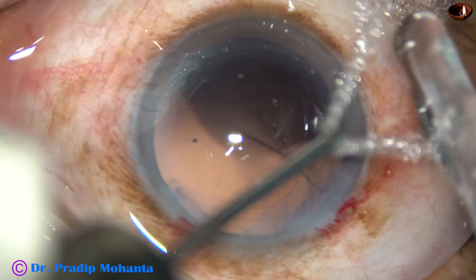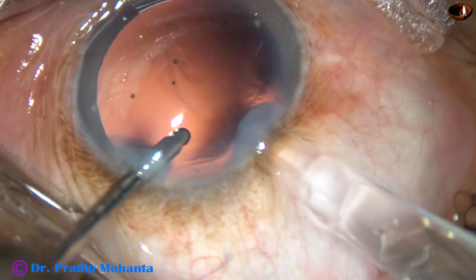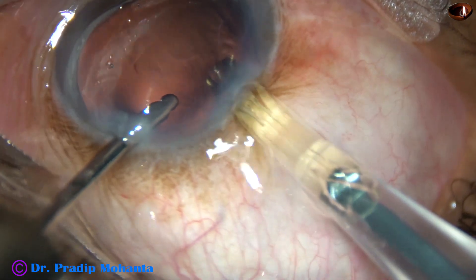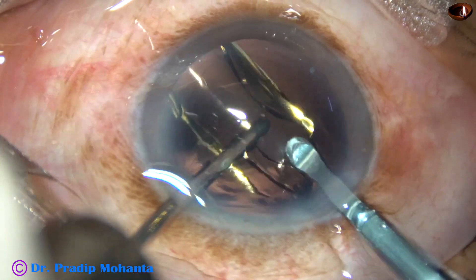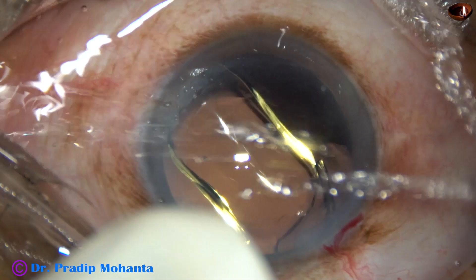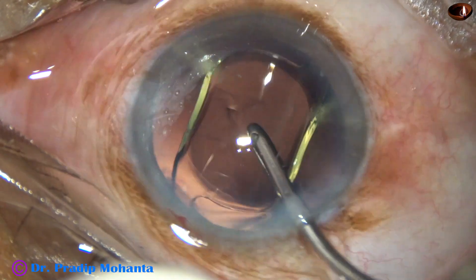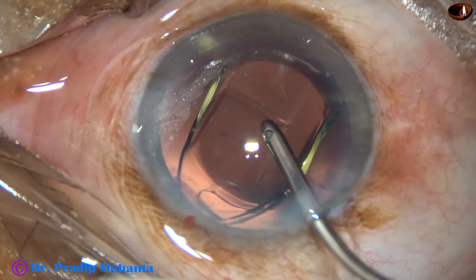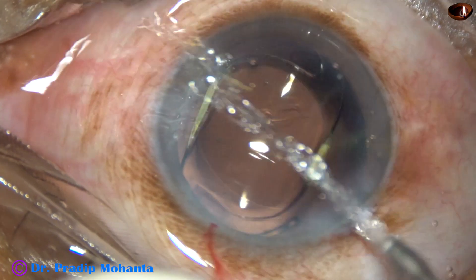Now a hydrophobic acrylic single-piece monofocal intraocular lens is being implanted, keeping the anterior chamber formed by irrigating fluid. The lens has gone into the capsular bag. The irrigating probe is used to dial the lens, and the irrigation removes whatever visco has been used in the lumen of the cartridge.